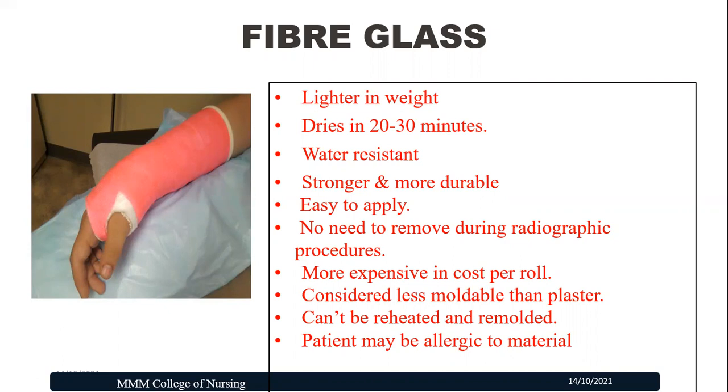But it is more expensive in cost per roll. It is considered less moldable than the plaster, and it cannot be reheated and remolded. Sometimes patients may become allergic to this fiberglass. This fiberglass is the synthetic cast that is available in the market.